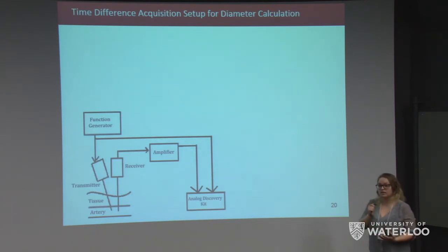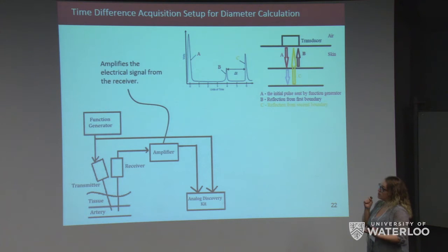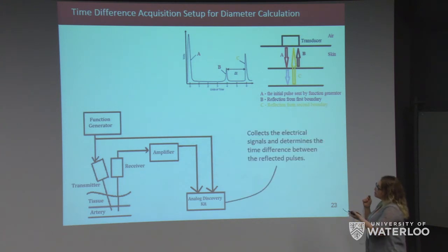We used a very similar hardware setup for diameter acquisition, where we look for the transit time difference. The function generator supplied a 5 MHz pulsed sinusoidal electrical signal to the transmitter. The amplifier took and amplified the received electrical signal. Both signals were sent to the Analog Discovery Kit, and the time difference between the two reflected pulses was determined.